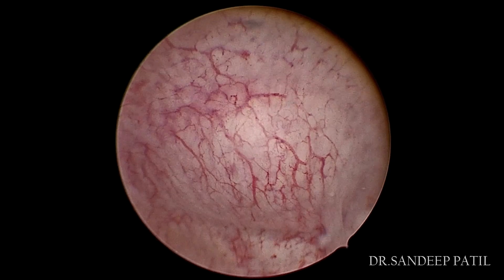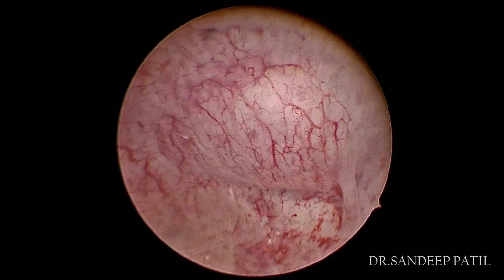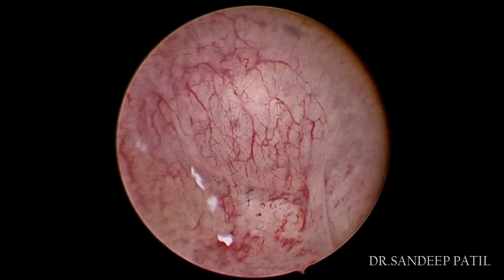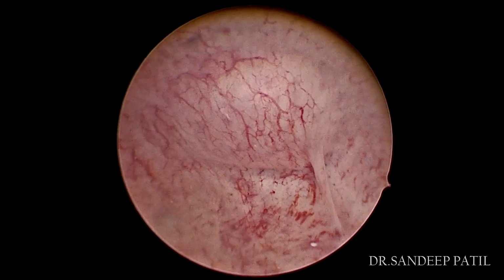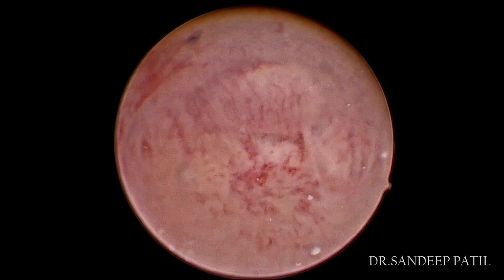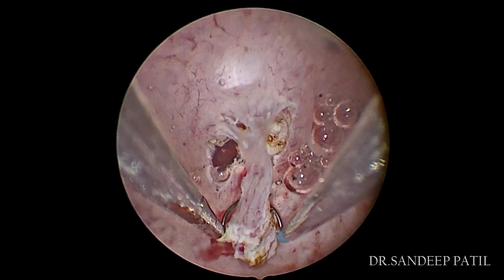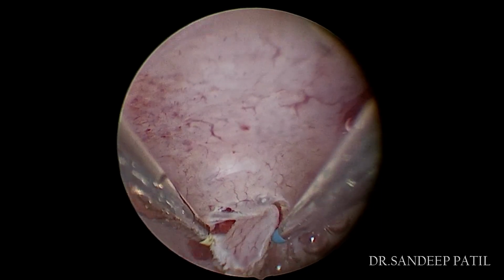Once this nuisance gets cleared off, we can notice a small bulge at the fundo anterior aspect of the cavity, and that's the impression of the underlying small fibroid. This is seen as a smooth, pale bulge with minimal protrusion into the endometrial cavity. This is characteristic of a FIGO 3 fibroid.